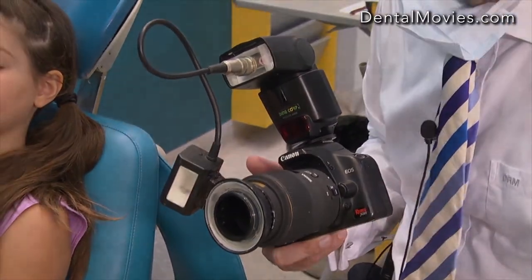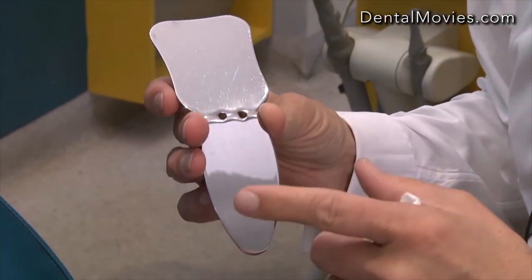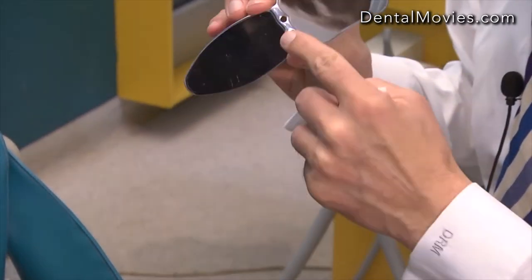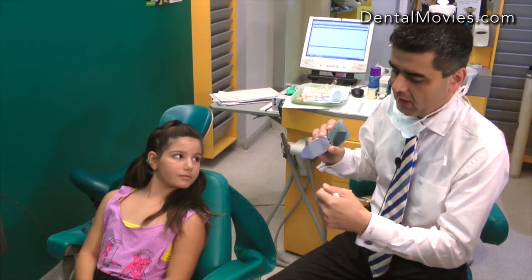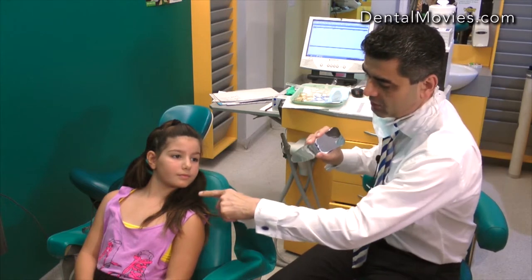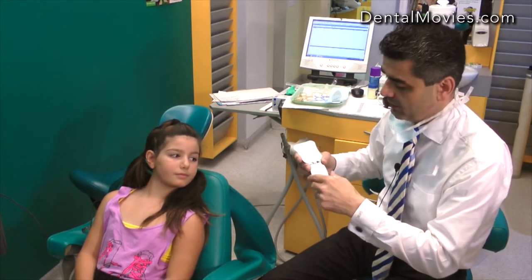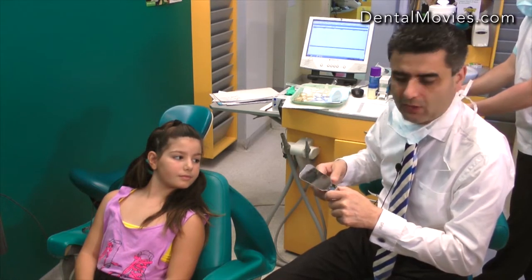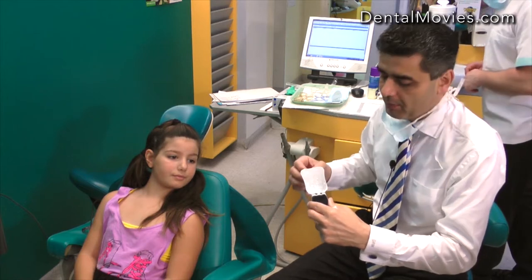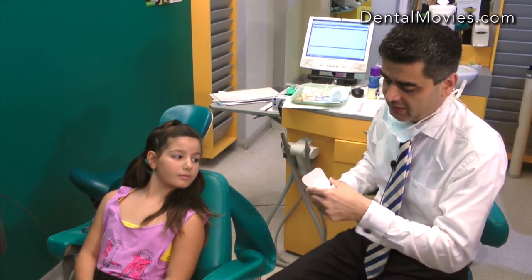We'll start by introducing the different mirrors we use. This is our intra-oral mirror, and it comes in three sizes: small, medium, and large. This is the small, which we'd use typically for a nine-year-old. It has an occlusal component and a buccal component. When taking the buccal shot, we retract on one side and place the mirror on the other — for example, taking a photo of her right buccal segment, we extend this way and shoot at 90 degrees to that reflection. For the occlusal view, we ask the child to open wide, place the mirror on the upper or lower, and again shoot at 90 degrees to that mirror.